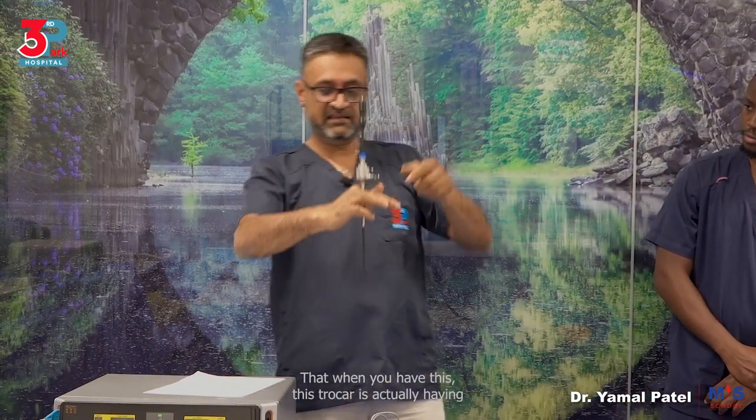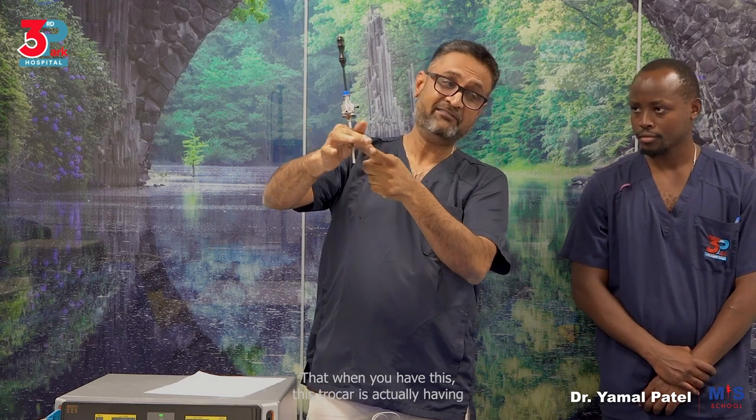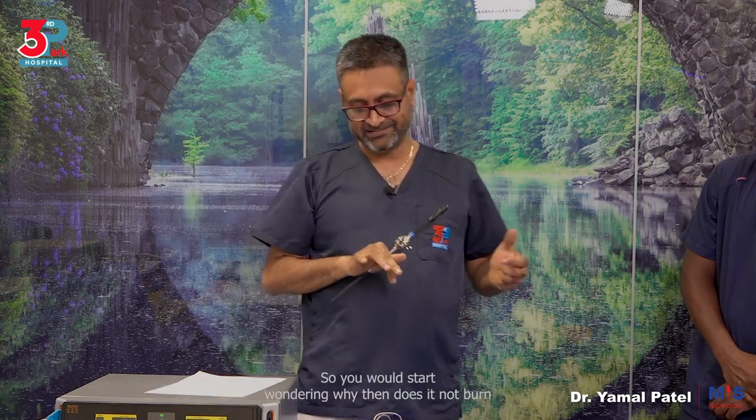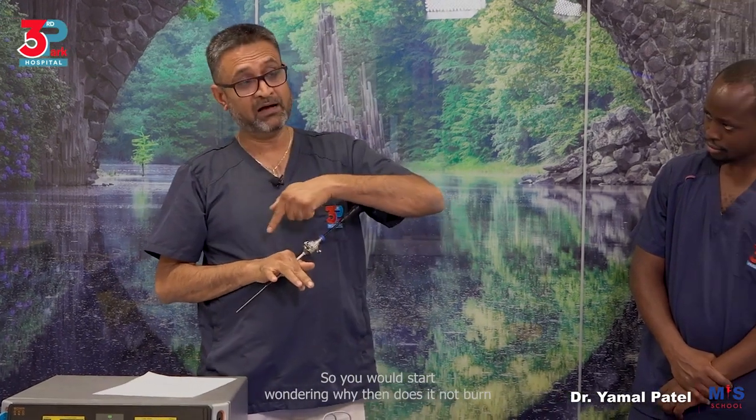That when you have this trocar, it is actually having electricity going through it and collecting as a capacitor. So, you would start wondering, why then does it not burn this patient's abdominal wall? Well, it does.